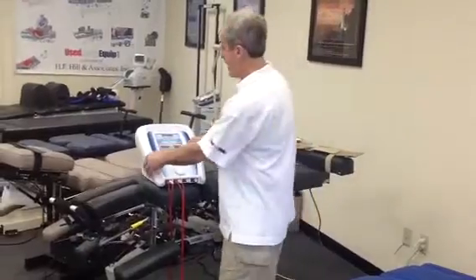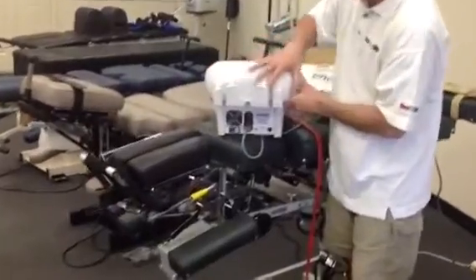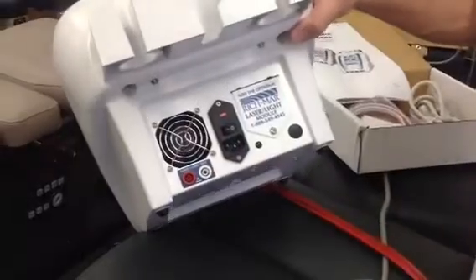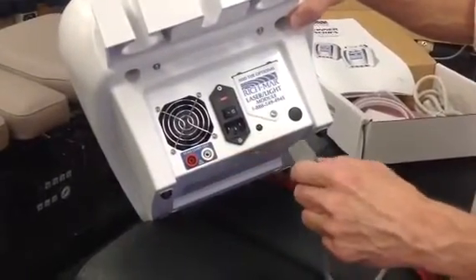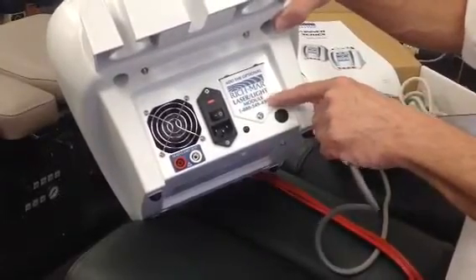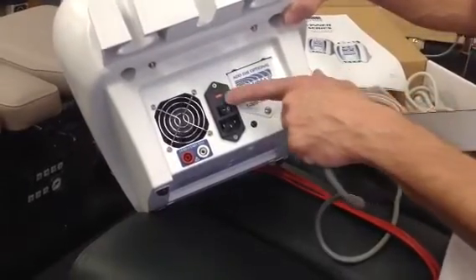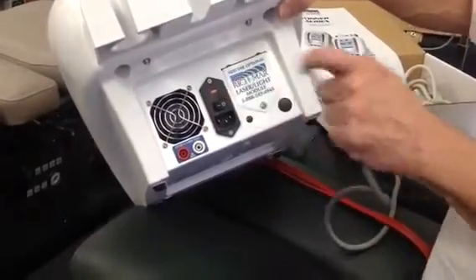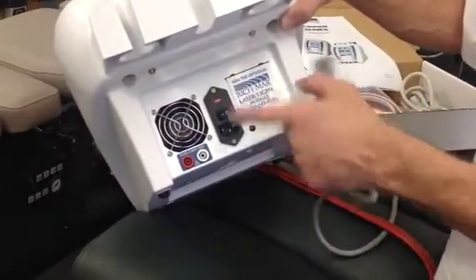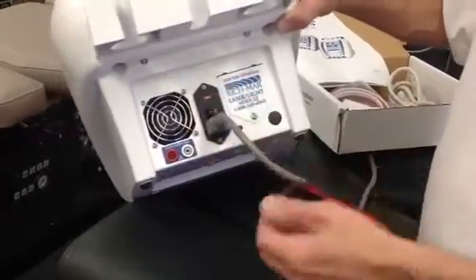I'm going to start with the machine. On the back of the machine, it has a power on button, of course your AC cord, and the lead cord test. It also has, if you choose to later add light or laser therapy, a spot where your laser therapy module would go. And up here is a fuse. It's in the manual: if you pop the fuse out and change the positioning of the fuse, you could actually use this device overseas. But we're not going to be doing that today.